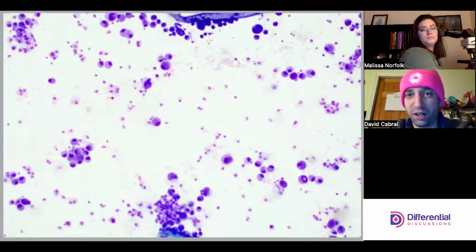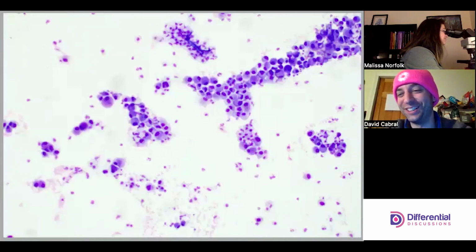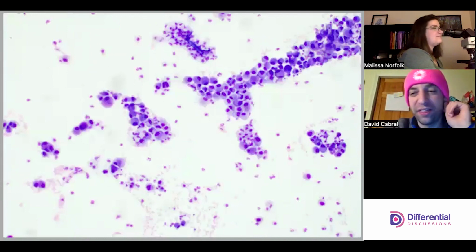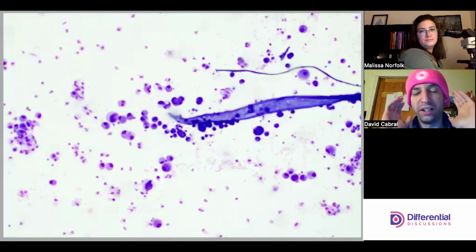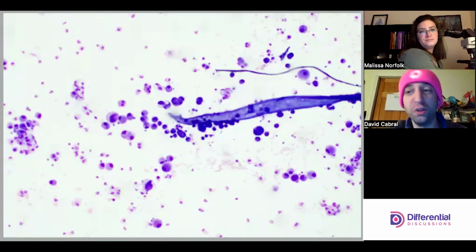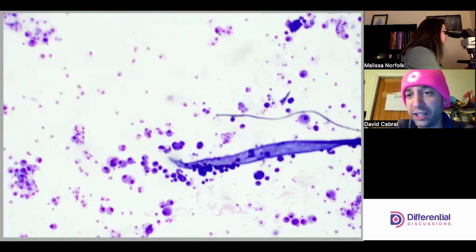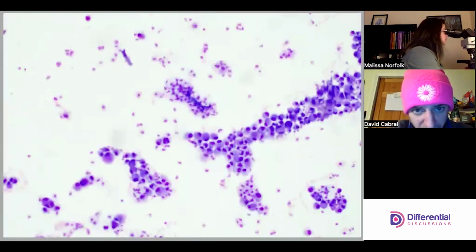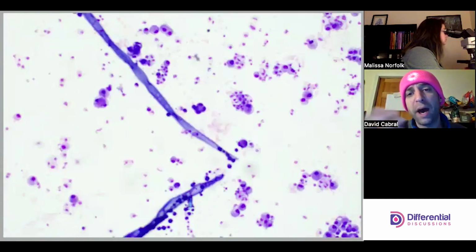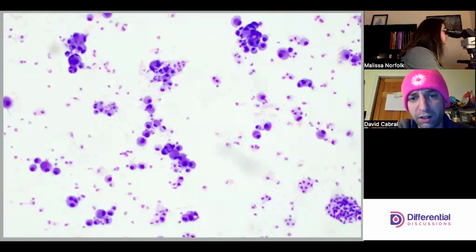A lot of large mononuclear cells around here. Oh, I saw one too just before you changed fields. I saw a nucleus of one of these large mononuclear cells, and that to me is 100% going to turn out to be a malignancy. I saw a ringed nucleus essentially. If you crack open your textbook and look at dyspoietic morphologies, that's one of the dyspoietic features. Not that hematopoietic cells will have the exact same features as a tissue malignancy, but certainly there is a lot of carryover.